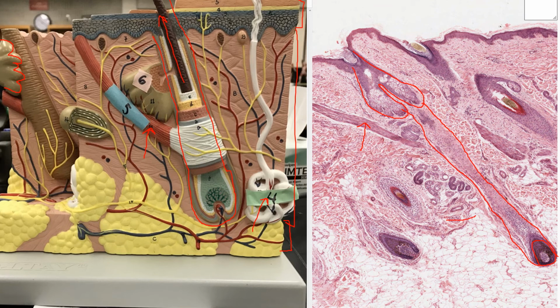This set of circles that you see down here, this is the coiled spaghetti of an eccrine sweat gland. We just can't see the duct because of the way this section is cut, but you can hopefully visualize that if we were to take this sweat gland here and slice it kind of in the plane of your computer monitor, you would get a whole bunch of little circles like this, little tubules.